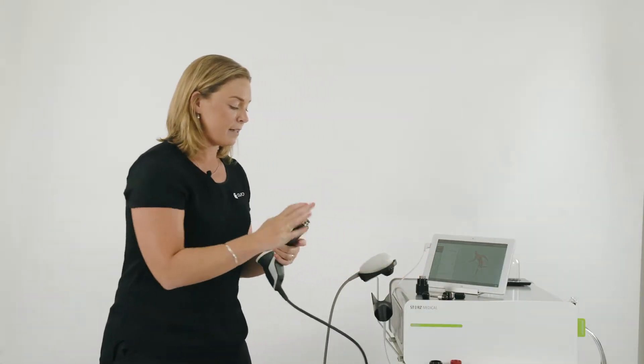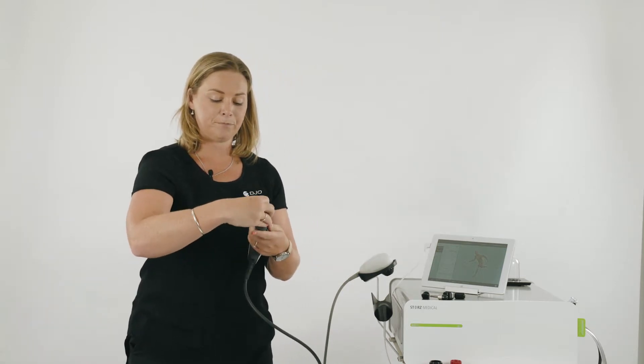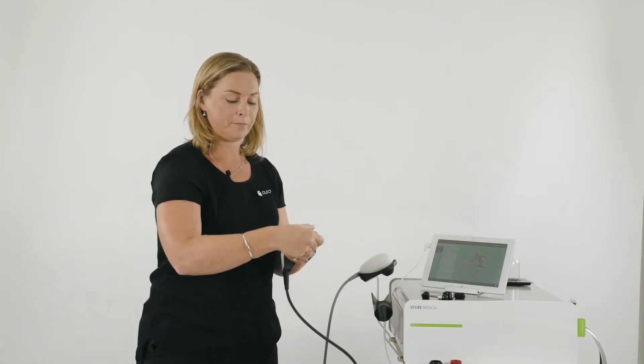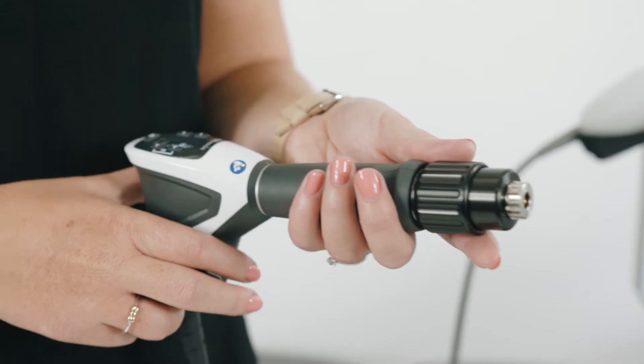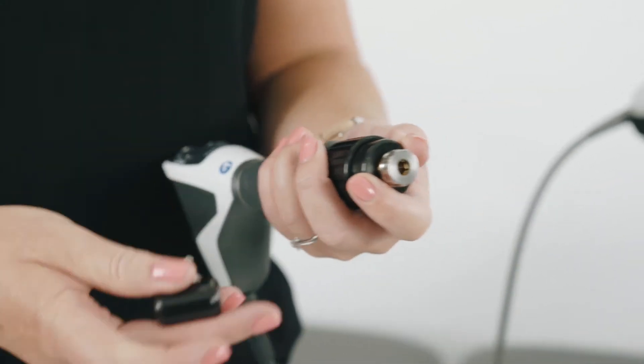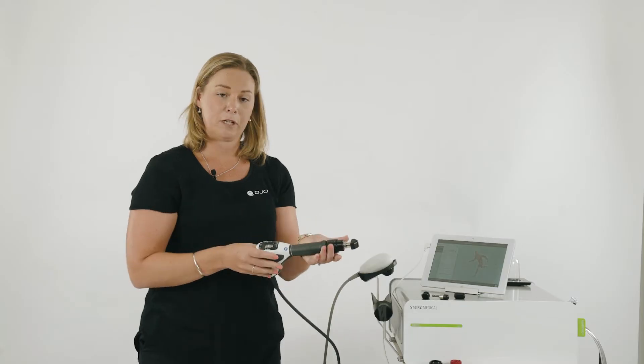To set up the peri-actor, very similar to the spine-actor, we attach the head and tighten that firmly. You're going to hold down the black cap, attach the peri-actor of choice, and release the black cap — and you're ready to go.